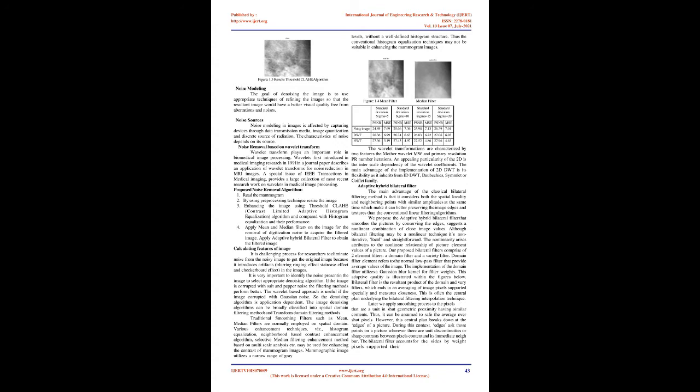significant grayscale contrast. Threshold CLAHE operates on small regions in the image, called tiles, rather than the entire image. Each tile's contrast is enhanced, so that the histogram of the output region approximately matches the histogram specified by the distribution parameter. The neighboring tiles are then combined using bilinear interpolation to eliminate artificially induced boundaries.